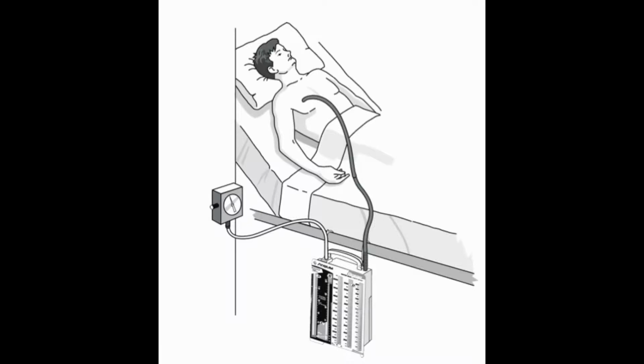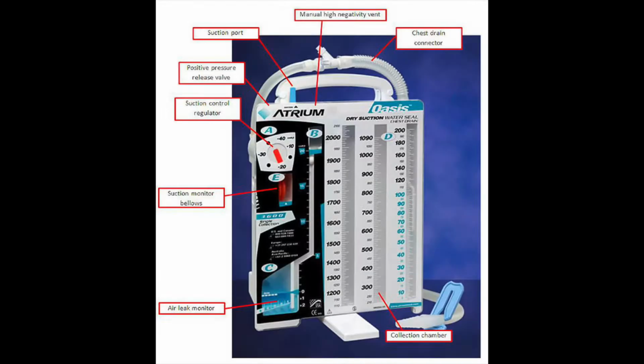We have to make sure that we're aware how to manage these patients, particularly because in the back of a moving ambulance heading from one hospital to the other, if there's an issue, we need to be on top of it and be able to troubleshoot and fix this pretty quickly.